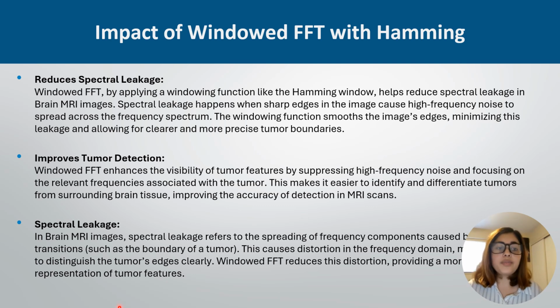Also, Windowed FFT improves tumor detection, enhancing the visibility of tumor features by suppressing high frequency noise and focusing on the relevant frequencies associated with the tumor. So Windowed FFT with Hamming makes a very high impact in tumor detection.